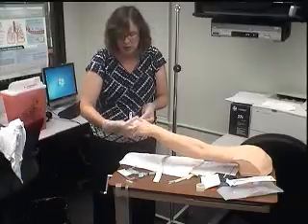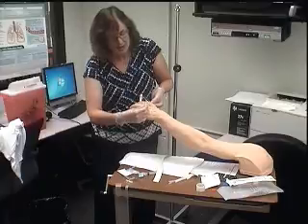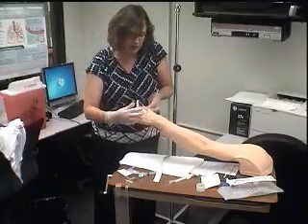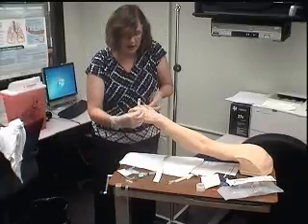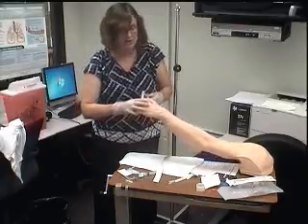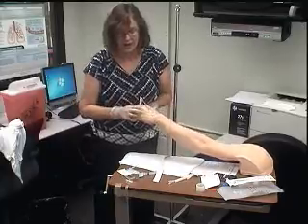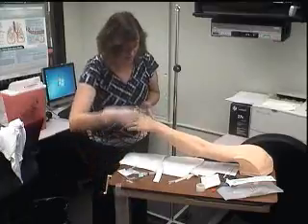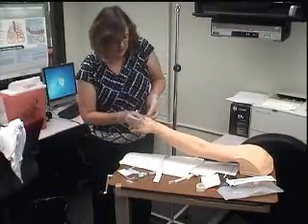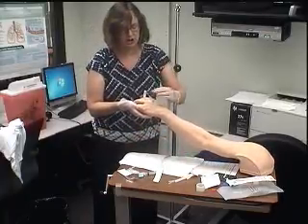So I put this about right here, sticky side up, and I'm going to make a chevron. So the sticky side is up, it's laying underneath there without disturbing this clear tegaderm dressing. I make a chevron by turning it on top of itself like this, and then I turn the other one on top of itself like this, and then I take the other piece of tape and I put that on top like that, and it makes a chevron. It makes it very secure.